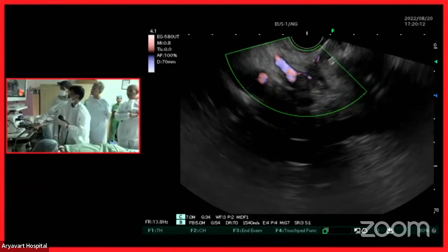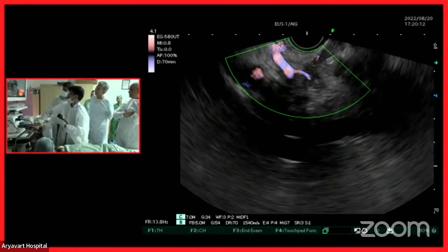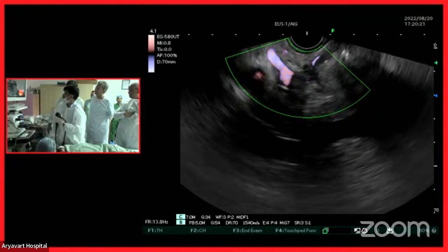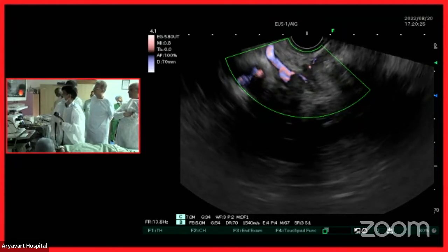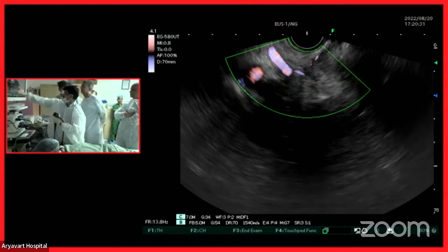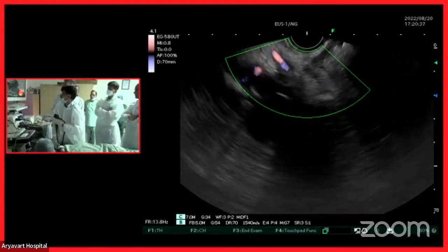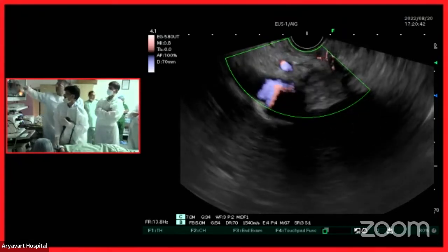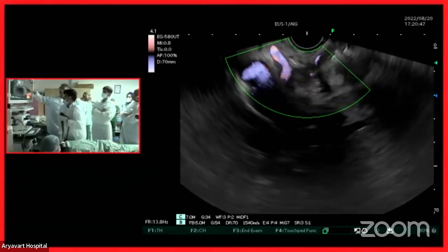That is a fantastic demonstration. So what branch is this, Dr. Malay Sharma? That seems to be coursing right through the tumor there. This one. So can you elaborate on this anatomy here? I think we're seeing the hepatic artery there. You have to follow it all the way. Before they start branching, this common hepatic artery, I would say probably it is at the origin of the gastroduodenal artery.